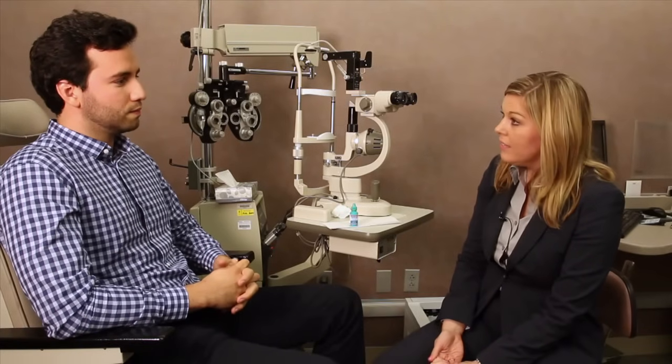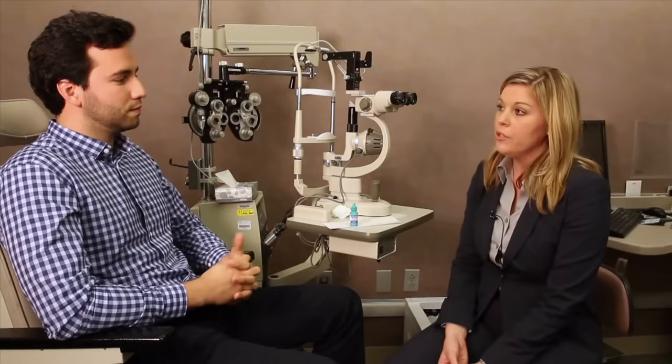Some patients wear contact lenses as well. If you're a contact lens wearer, be sure to remove your contact lens before instilling the eye drop. Prescription eye drops are not intended to be used with contact lenses. Before resuming contact lens wear, double check with your eye doctor to make sure it's okay.